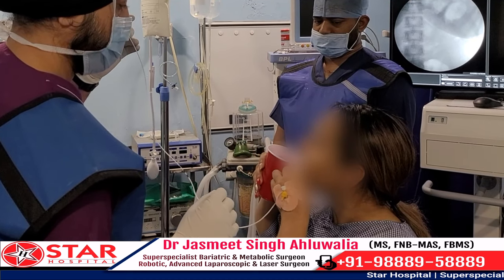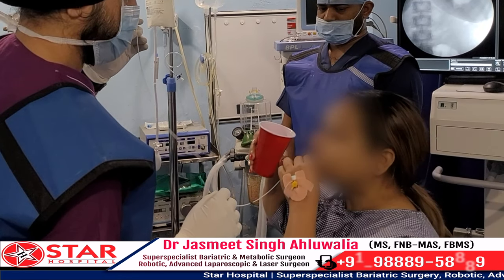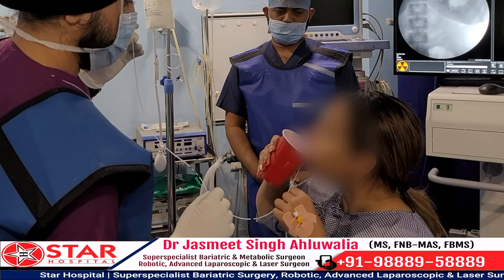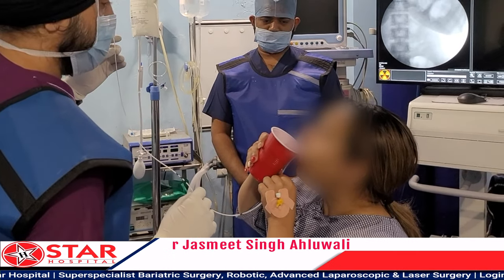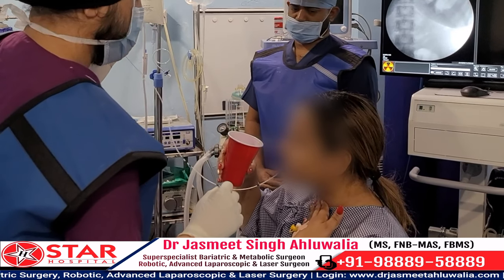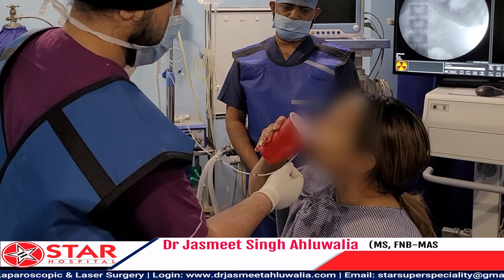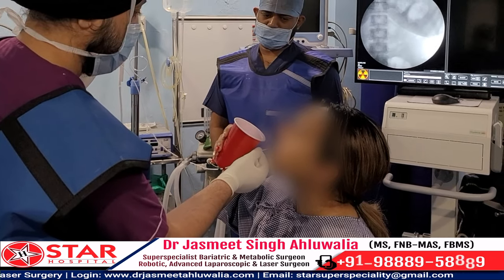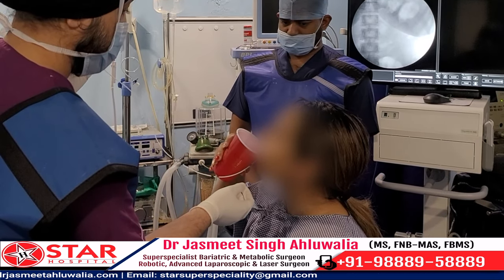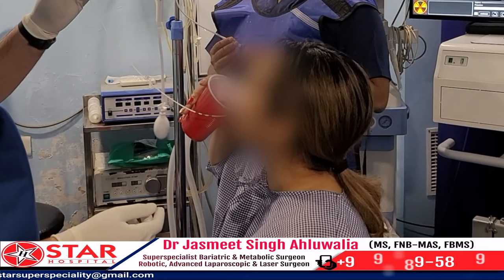As soon as the balloon is down the throat it becomes very comfortable for the patient to drink it down the food pipe. As you can see here, she is gently pushing the catheter inside and then drinking water in between. Within a few seconds this balloon is going to cross the lower end of the food pipe. There may be an occasional retching and you may feel a bit uncomfortable, but within a few seconds the balloon will usually pass down and be inside the stomach.